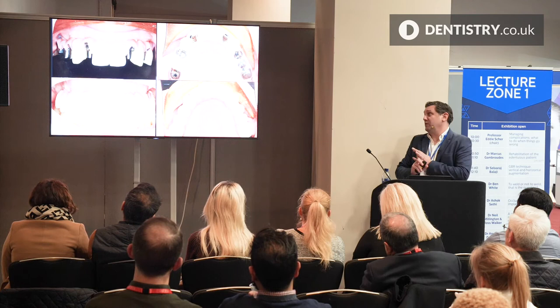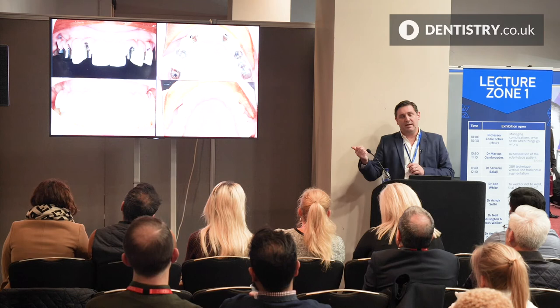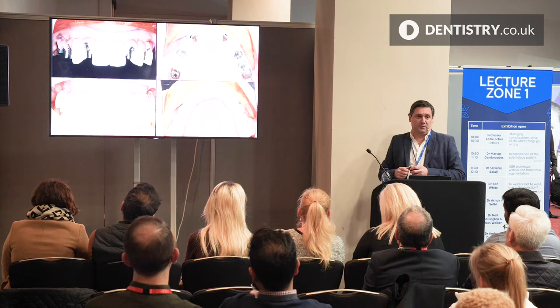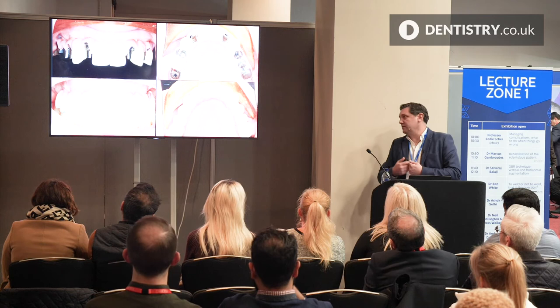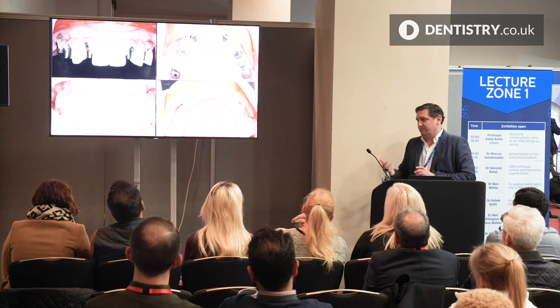If a patient were to break or chip a bit of porcelain, all we have to do is remove the crown that's broken. These are milled EMAX crowns, so we just phone up the lab, say patient's broken upright six, they can mill a new crown, send it back to us, and we can put a new crown in place for you. You haven't got to take the whole restoration out, send it back to the lab, get it repaired. So it reduces those risks to the patient long term. So it's minimizing our risk as a dentist as well. So if anything breaks or happens to it, we can sort it easily.